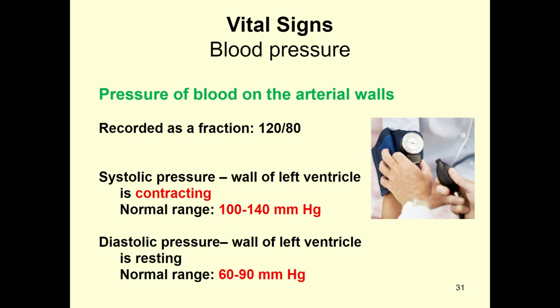For this unique situation, I'm going to link a couple of videos where you can watch it explained a little bit better. I'm also going to link to a game where you push play, and it will give you the sounds that you're going to hear when you're actually taking a blood pressure, and it'll show the blood pressure dial, the sphygmomanometer dial, and what it does. It's not a perfect game. Every now and then you'll put in what is a right answer and it'll tell you it's wrong, but it will really get you used to listening and hearing at the same time you're seeing the little sphygmomanometer move. So I recommend playing that over and over in lieu of actually being able to try it.